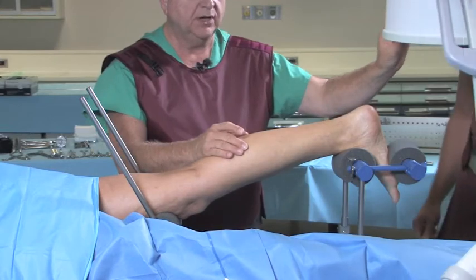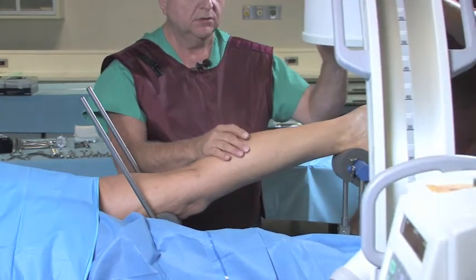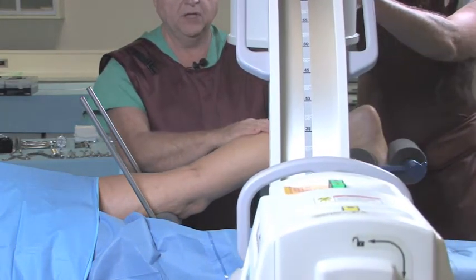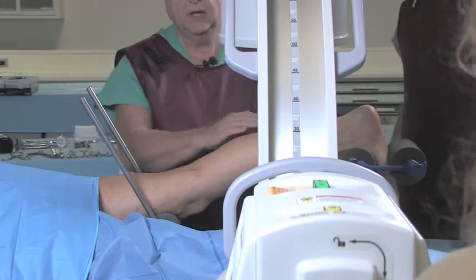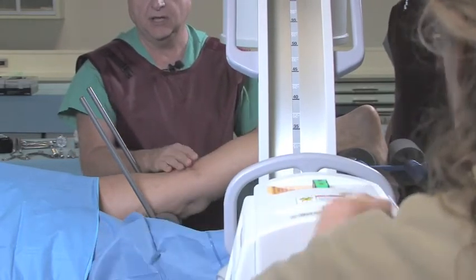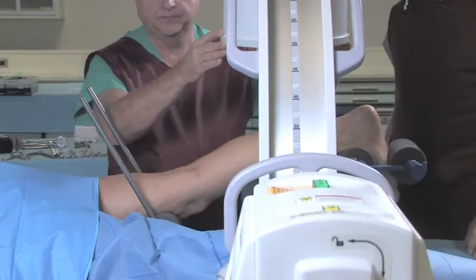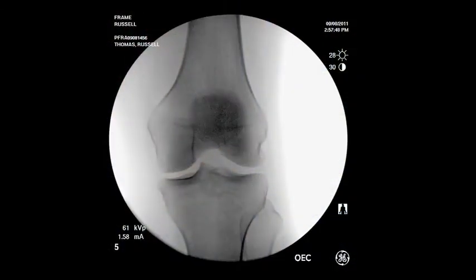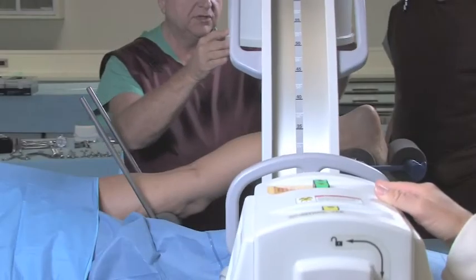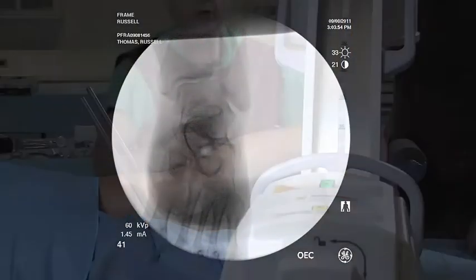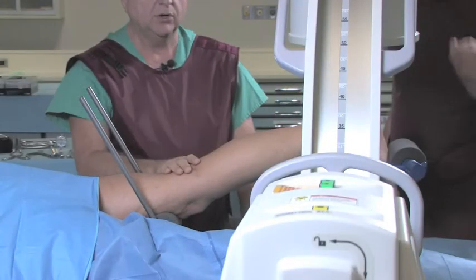For the use of the C-arm in this setup, we'll bring our C-arm in. Lock it in the mid-tibia. And now we can swivel up and actually visualize the knee, or swing it distal for visualization of the distal tibial joint. We can go into a lateral mode.